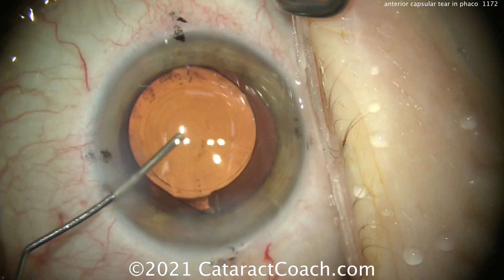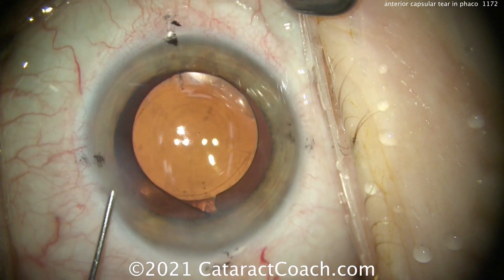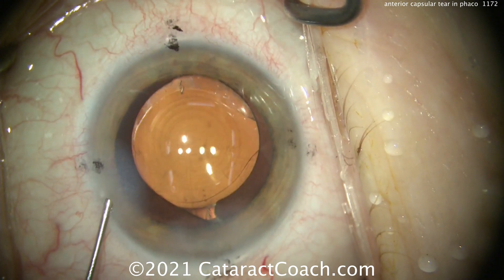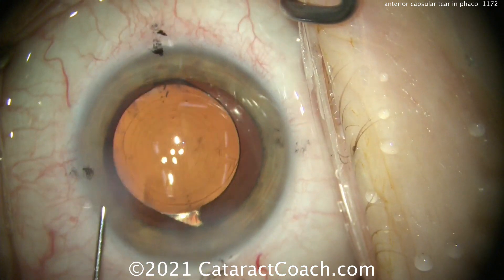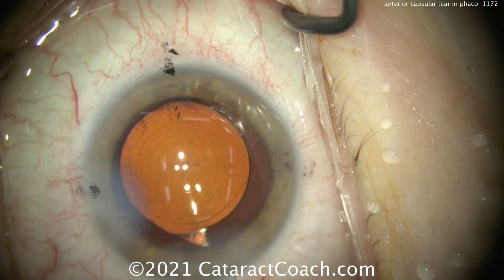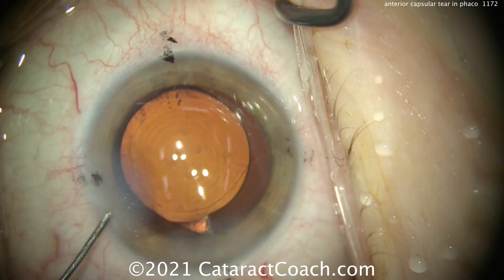This lens is going to be perfectly fine, perfectly stable — there's really no issue here. We just dialed in the exact position we like here at the end and it should stay. Because remember, the lens is a little bit tacky and it will adhere to the posterior capsule. We're just lining up the two Purkinje images to avoid parallax, and once we get those lined up, that looks fantastic. Toric marks also in pretty good alignment.